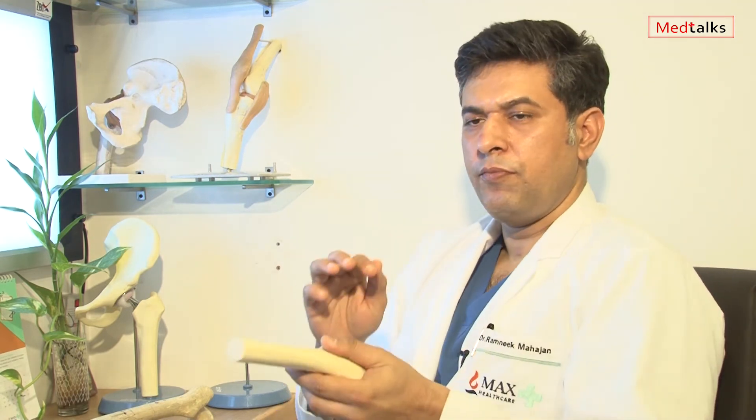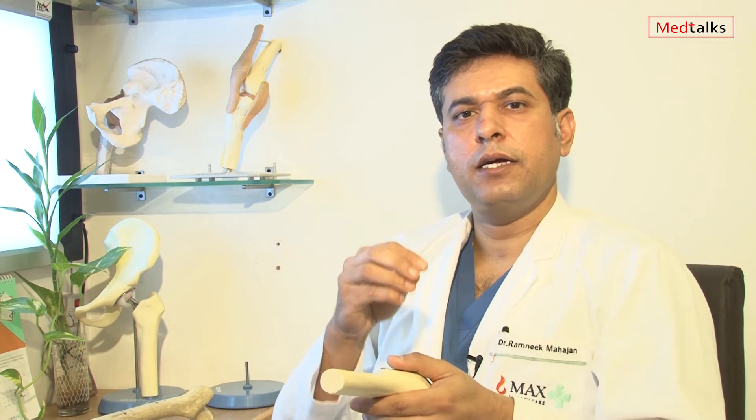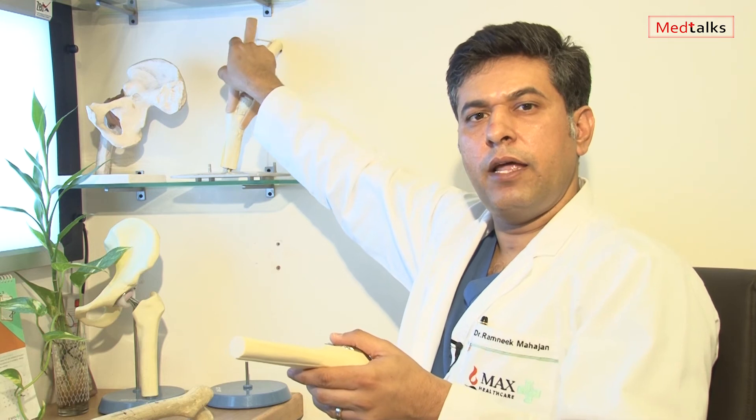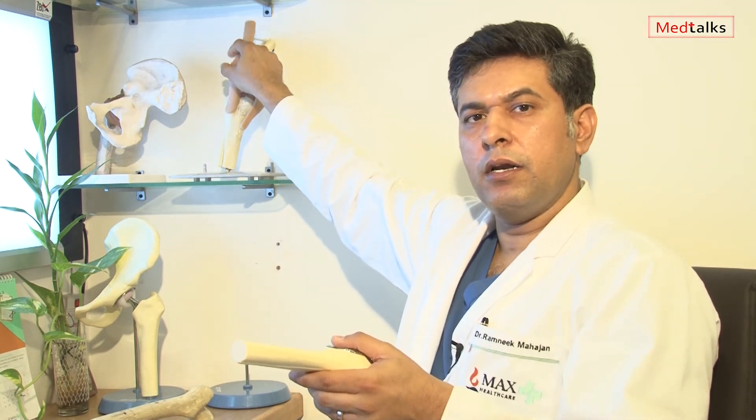The patella is a button on top. Sometimes if we find that the patella is also involved, this is what the patella looks like, and then we change the patella button — otherwise we don't change the patella. Patella replacement is still debatable; some literature shows that the patella needs to be changed, while some says it does not.